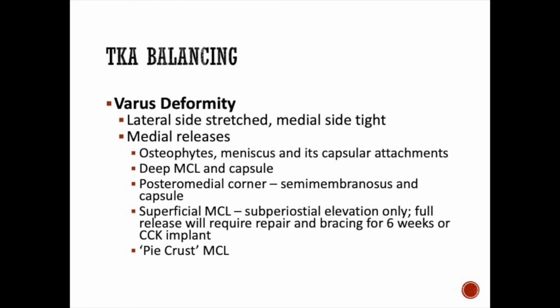So that means the lateral side is stretched out, the medial side is too tight, and so you have to do some medial side releases to get that medial side to open up and match the lateral side. So the first thing you always start with is osteophytes off of the medial femoral condyle and the medial tibial plateau. You want to make sure you've removed all of the meniscus and its capsular attachments.